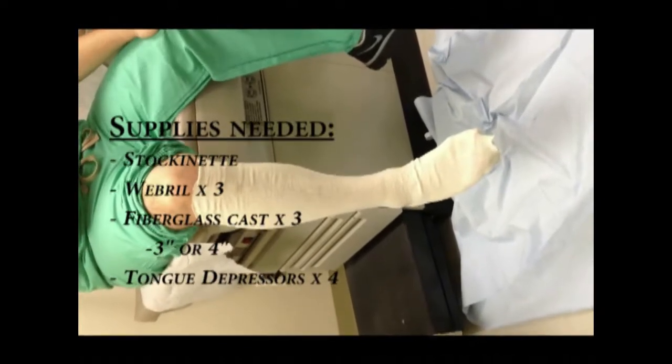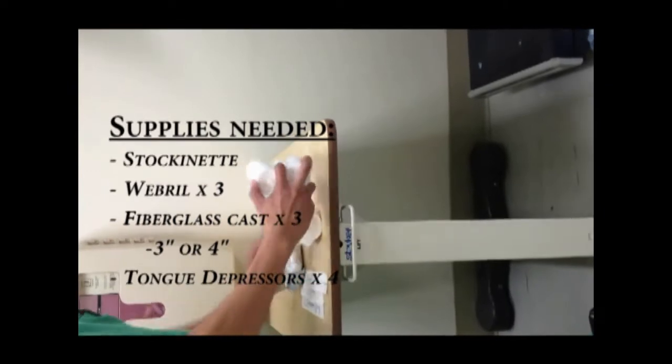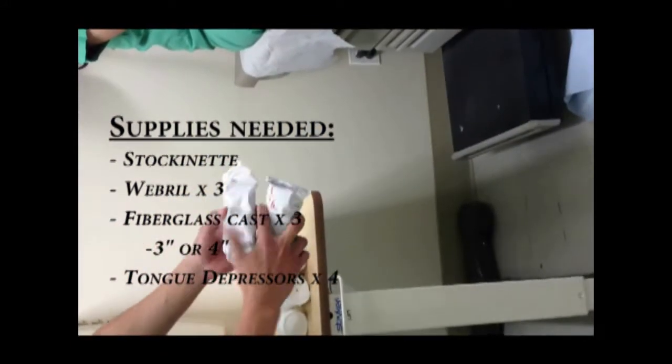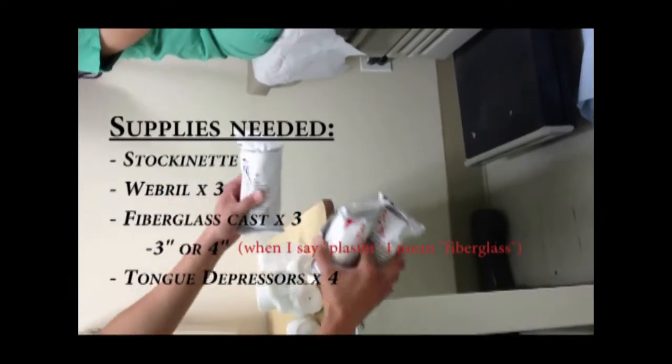We're going to put on a cast today for all those who want to know how to put on a cast. We already have the stockinette over the leg. We have other supplies here: the web roll. You also need a couple of tongue depressors. It's probably a good idea to start with two 3-inch plaster casts and one 4-inch.